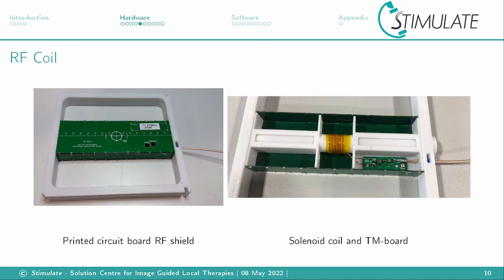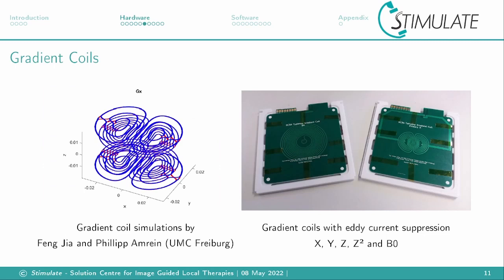But instead of copper tape as an RF shield, which is unreliable for tuning, we changed the design to 4 PCBs in a rectangular shape that get soldered on the edges. The designers of the original tabletop gradient coils, Feng Jia and Philipp Amrein of the University Freiburg, simulated a new set of gradient coils for us, which fits our construction.